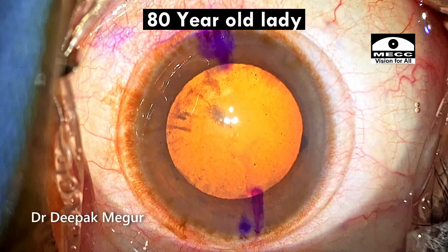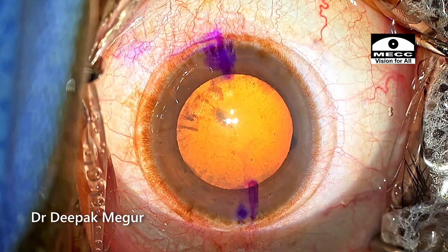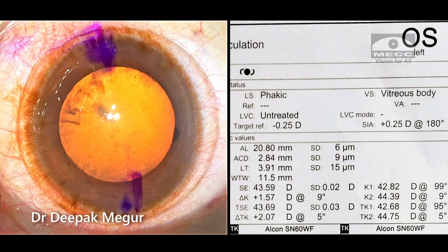She is an 80-year-old lady who is posted for a toric intraocular lens, and these are our biometric findings. We can note that we're dealing with a hypermetropic eye — the eye is smaller — and let's see how things turn out.